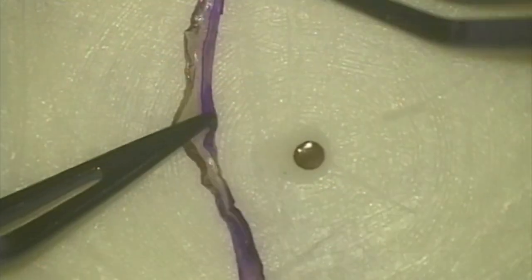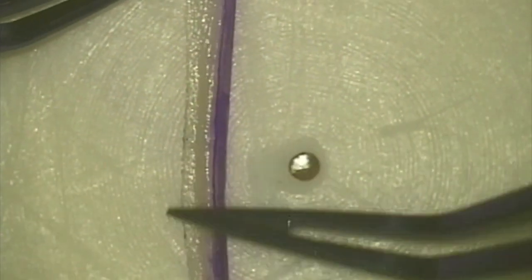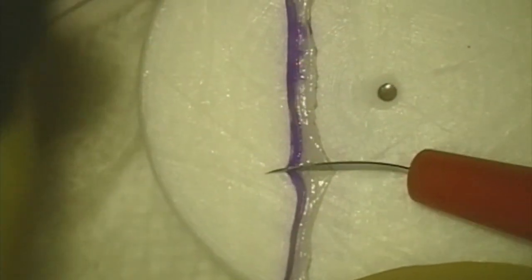I then cut it into a longitudinal segment of whatever length I would like to use. I flatten it out, and you can see that the part of the cornea towards the Bowman's side flattens less than the endothelial side.